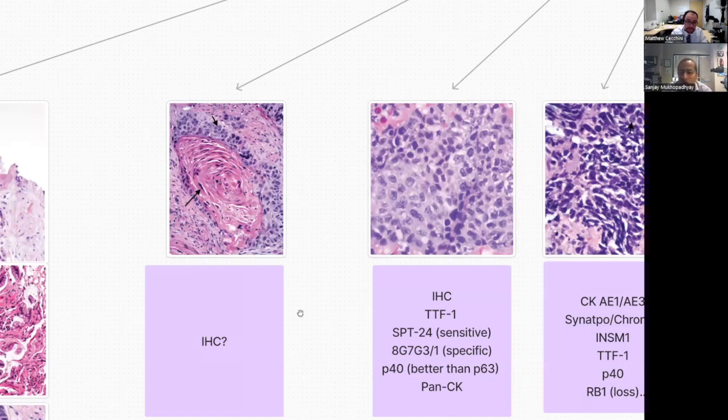So you should not feel the pressure to commit. And if the clinician asks you, is this a met from somewhere else? You ask them, from where? From where would it be a met from? Do you have a primary somewhere else? Yeah, I ask them, and that happens in adenocarcinomas too.